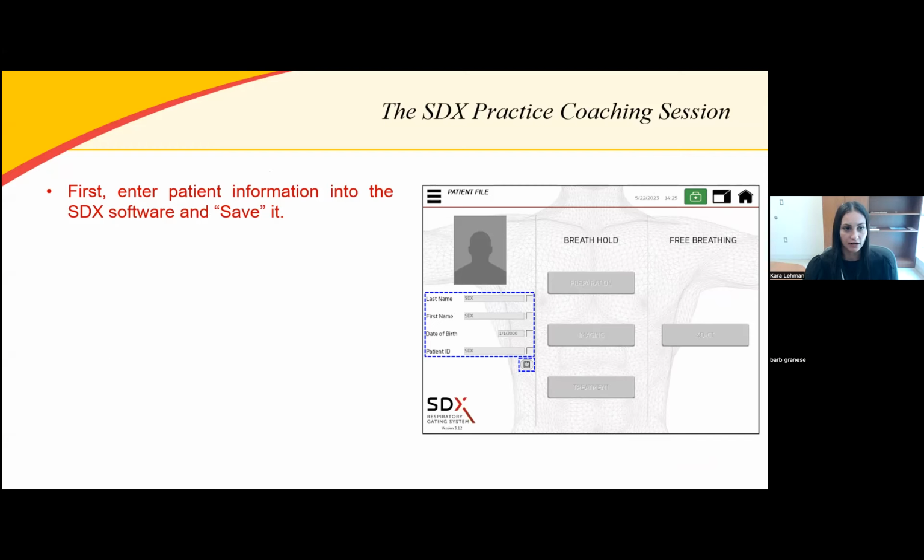And then the second part of the practice coaching session is having the patient hold their breath for a few different periods of time. So beginning with the first part here, you'll first begin by entering the patient's information into the SDX software, and you want to save it. You'll enter the patient's last name, first name, date of birth, and patient ID number. We use the patient's hospital ID number, but really any patient-specific identifier will work.